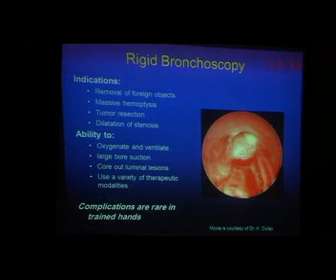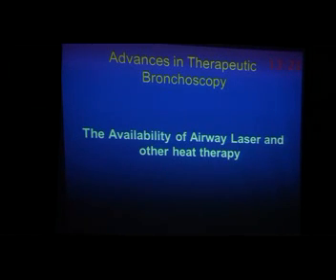That's the laser. I mean, it's a mass inside here, whether it's a foreign body or mass. Anyhow, bronchoscopy is very important in this issue and to perform and debulk this mass. We have the laser, we have the electrocautery as well. However, the laser in our country has a lot of problems concerning the post-sale service. We have two engines and two machines, but unfortunately the dealers didn't work well with us, so we usually perform the electrocautery.